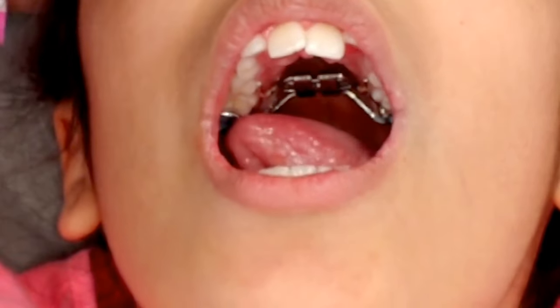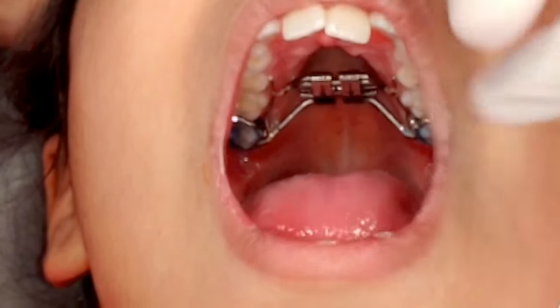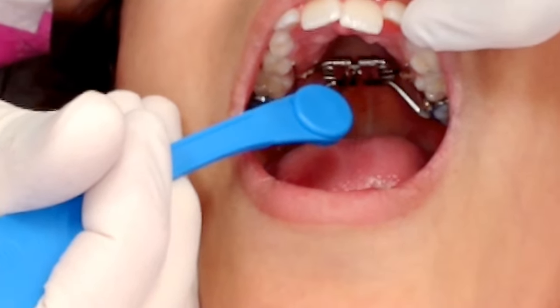Today we're going to learn how to turn a palate expander. The first step is to take the key. You're going to have the key pointing straight, and we want to put the key inside the hole.